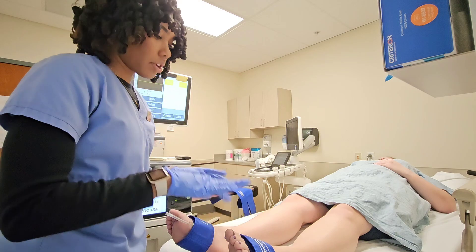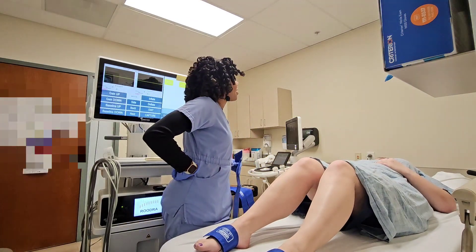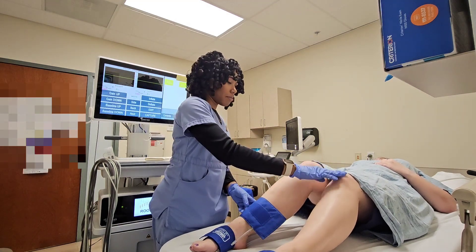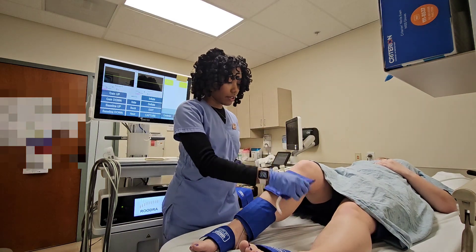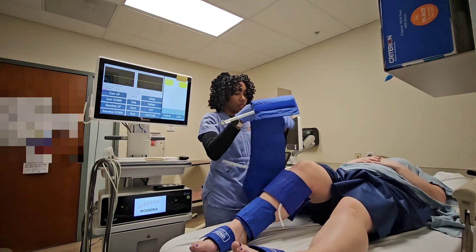We're starting with the seven centimeter cuffs on the feet. I usually do one leg at a time. Everyone gets these cuffs on a little bit differently. We have 10 centimeter and 12 centimeter cuffs, and then 17 centimeters for the thigh.